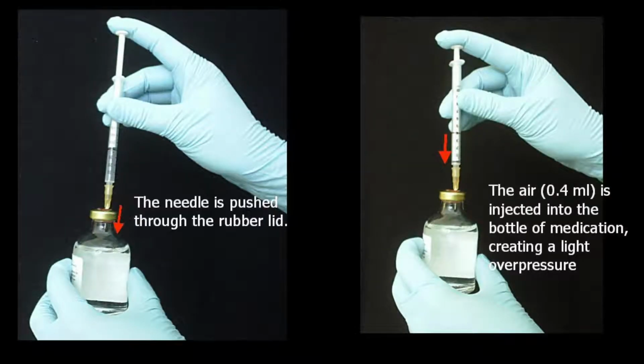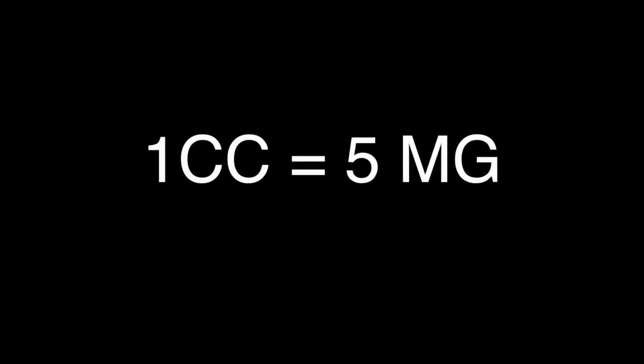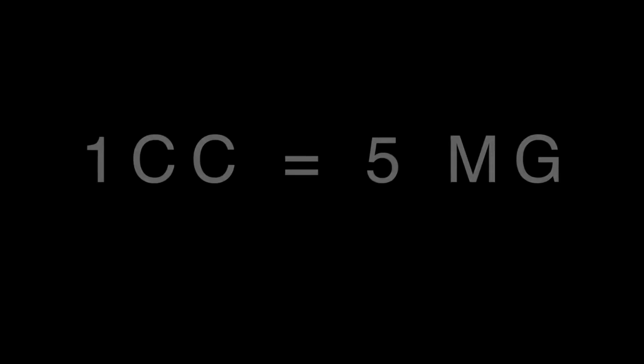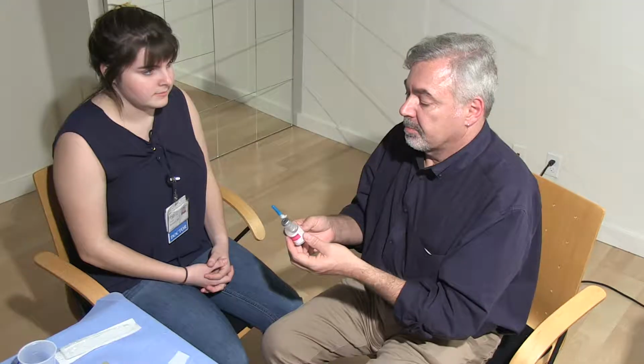After a final cleaning of the med bottle stopper, I am withdrawing 1 cc of air into the needle to inject into the med bottle. I am now withdrawing 1 cc of Reglan, which is equal to 5 mg. After removing any air from the syringe, I will recap the needle and present to my provider for review.